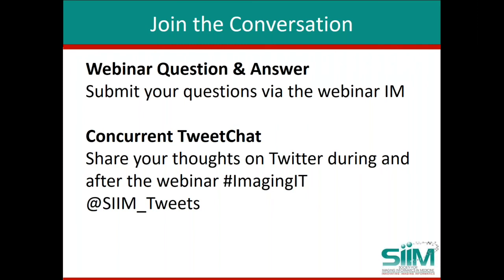Great. I want to quickly go back to the fact that we can also integrate very easily thanks to the API. It's a REST API, so every feature within Orthanc can be called through this API.